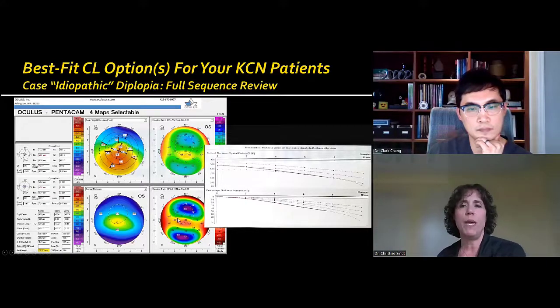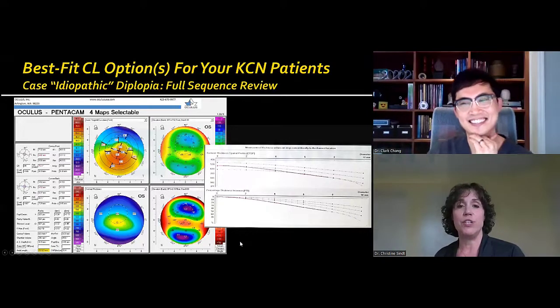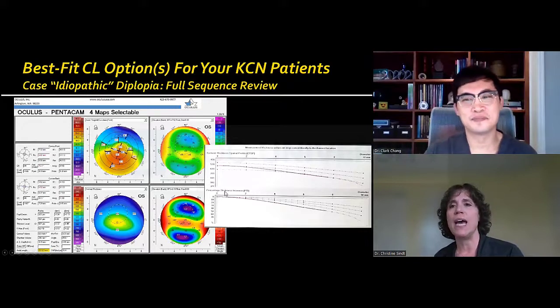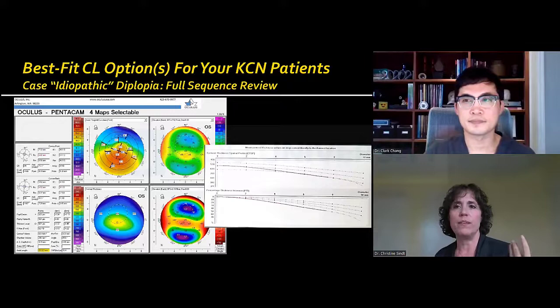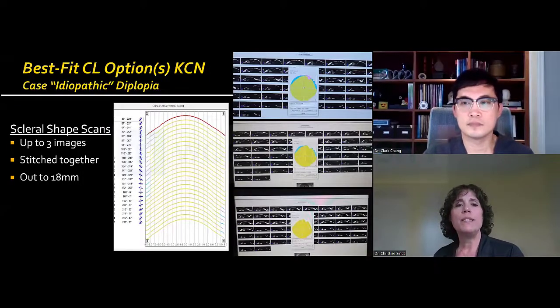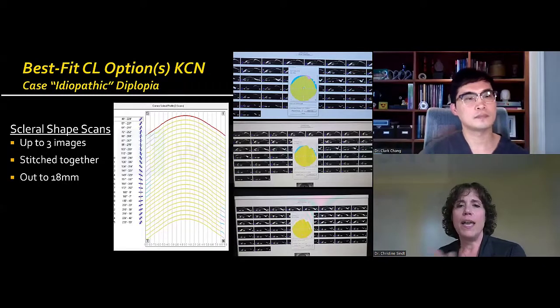And I really could have picked, again, central cone, right? I could have done a corneal GP on it. Certainly there would be economic benefits to that. This particular patient worked outside, in a dusty environment. And when I went through the options, he actually wanted to go with a scleral lens. And next. So we decided to do the CSP option, where we did the corneal scleral profiling.